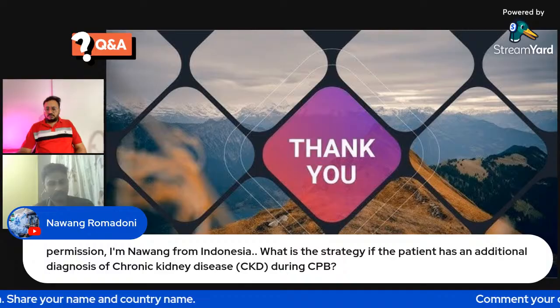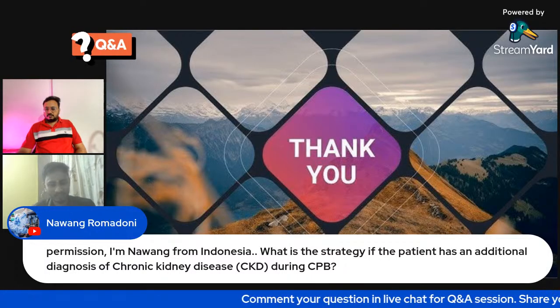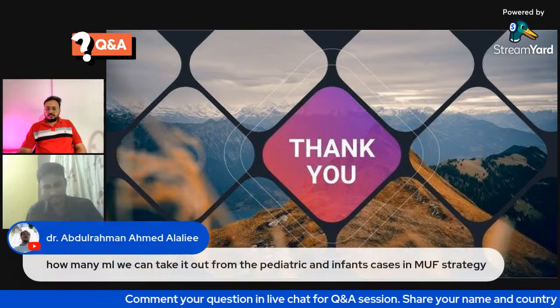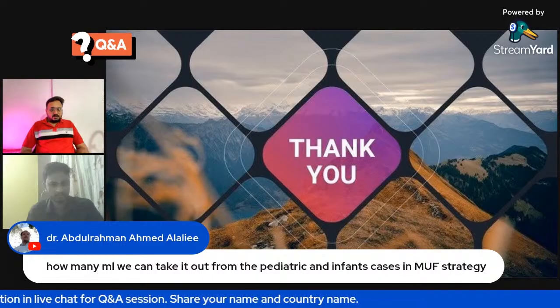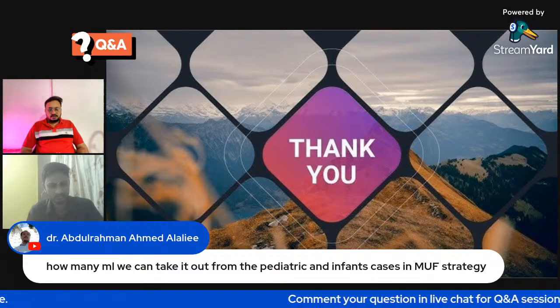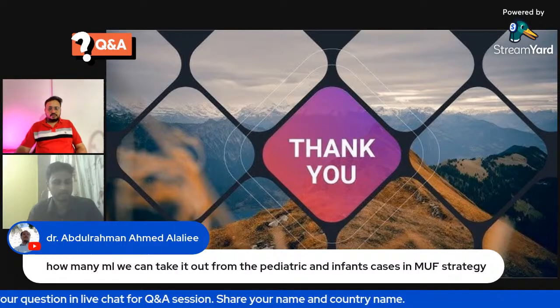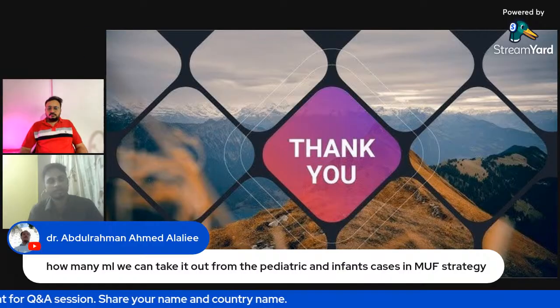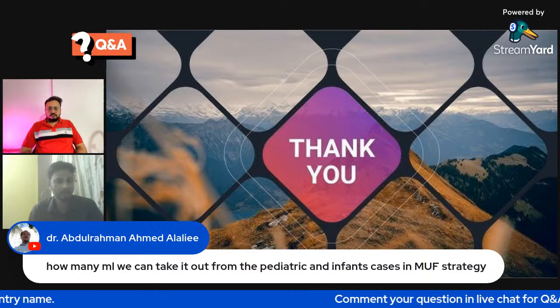Okay. So we have one more question. It is from Dr. Abdul Rahman Ahmed Alaili. How many ml can we take out from pediatric patients and infants in the MUF strategy? Around 20 to 100 ml. It depends on the patient weight and the patient arterial pressure.